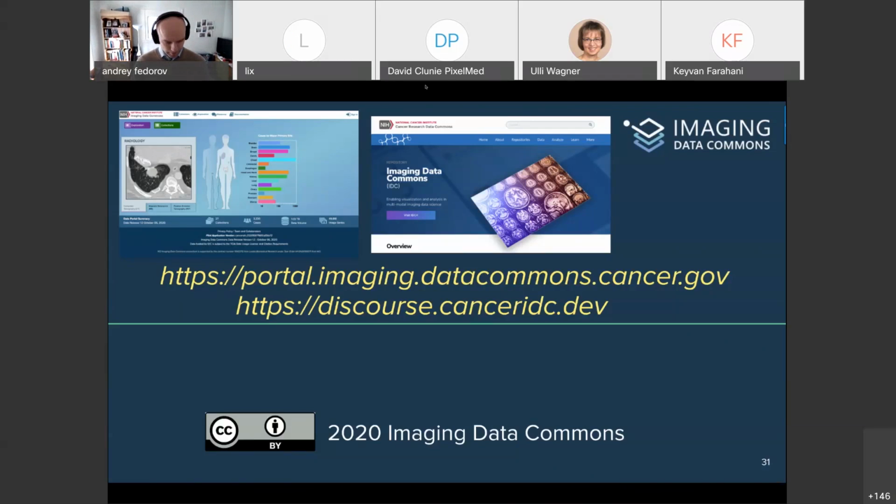I can also address that in a bit more detail. Most tools use one of a couple of different libraries to ingest their data. We want to make sure that those libraries are capable of ingesting the DICOM format, even though we do have to fall back to the dual personality TIFF as mentioned.